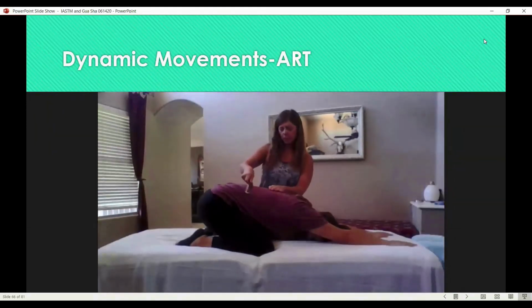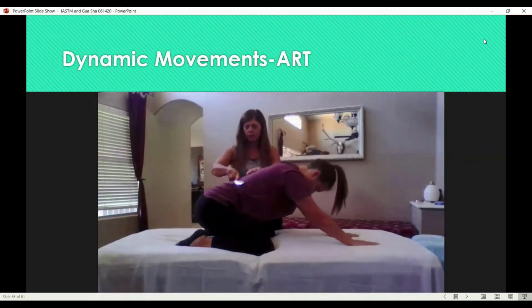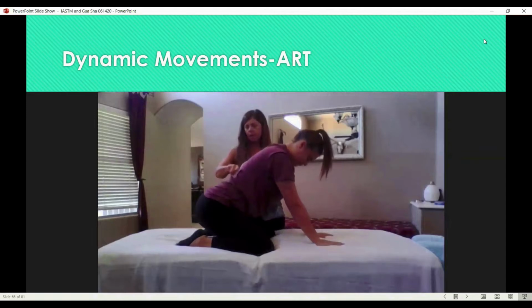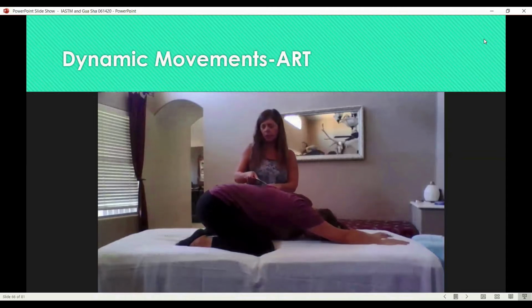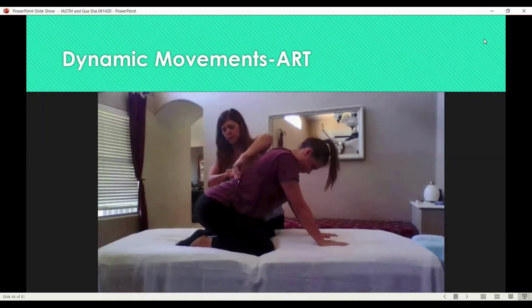And so before I was working the obliques, or lat attachments, we can do it in multiple positions. I could do it on the table here. I like some of these active motions, but they're hard to achieve while they're on a table during a massage. But here's some active release for the low back. I can do some brushing and sweeping and strumming and all kinds of stuff down the back while I have her do some active dynamic motion.